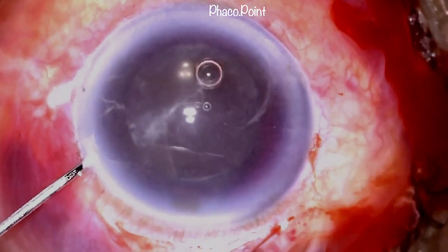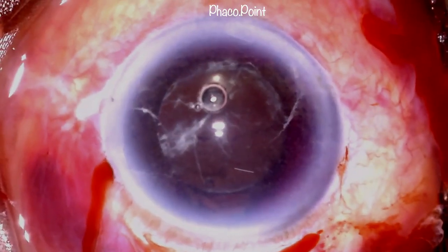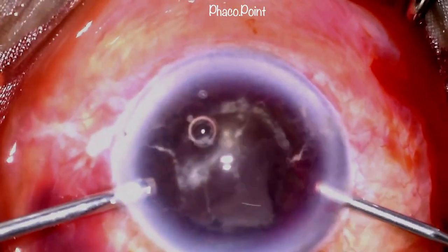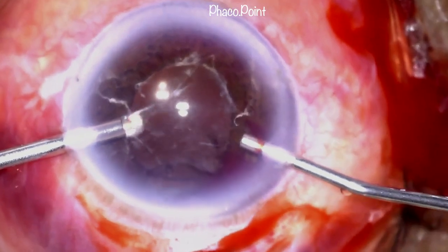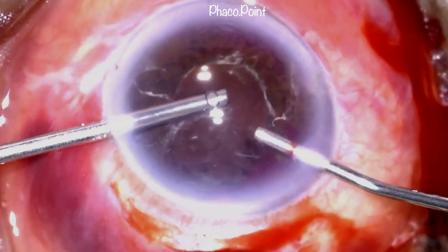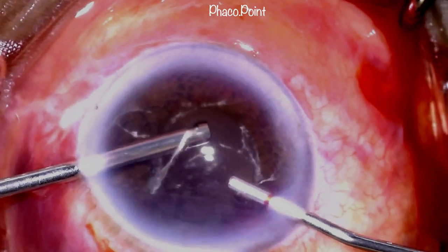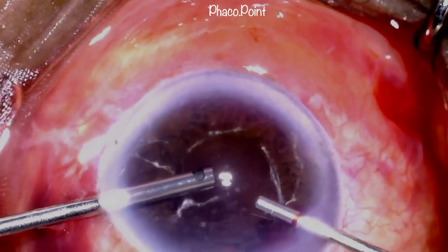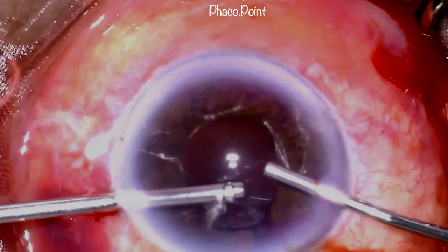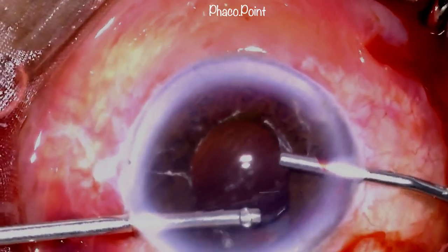After washing it out, it becomes amply evident that there is a significant vitreous disturbance in the anterior chamber. I now proceed to performing a limited anterior vitrectomy. In order to do so, I introduce the irrigation through one of the side ports and a 20 gauge cutter is introduced through one of the paracentesis incisions, and you can see how we then proceed to performing a limited anterior vitrectomy and cutting all the disturbed vitreous from the anterior chamber. The cut rate in this case is kept at about 800 cuts per minute and the vacuum no more than 150 millimeters of mercury.